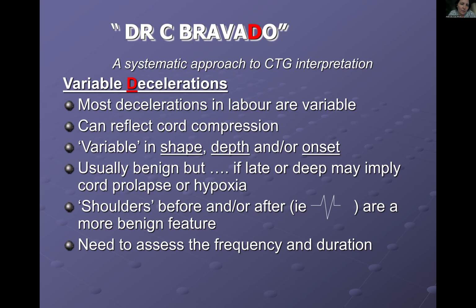So although they can be benign, right? Usually, if the patient is lying on her back and she changes to one side, they tend to disappear. So there was cord compression on one side. You change position and it's better.